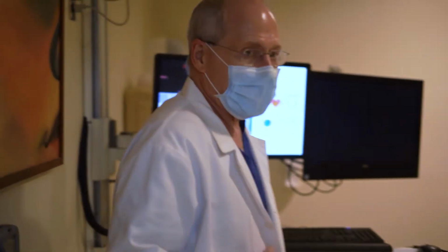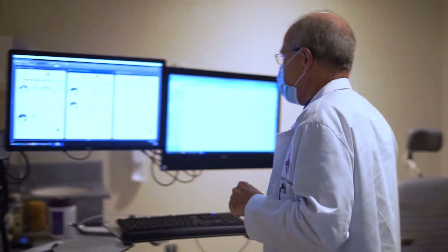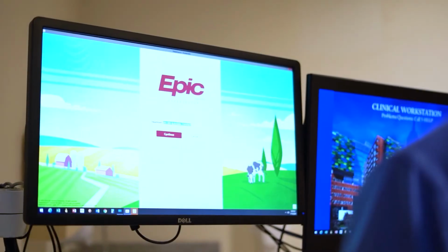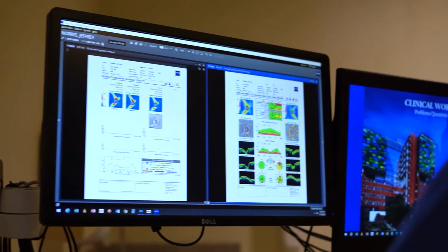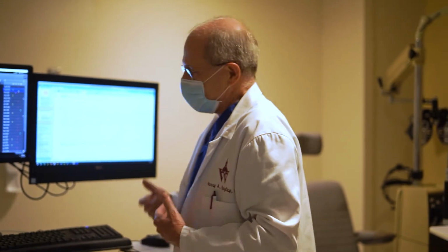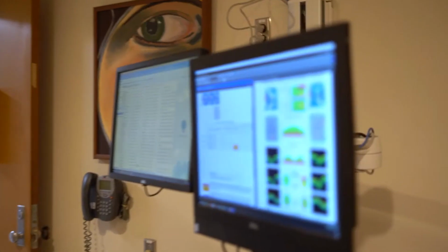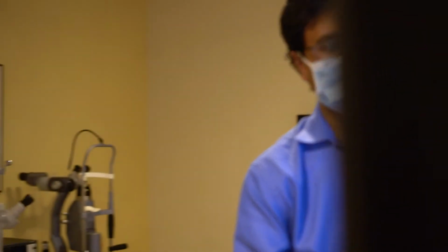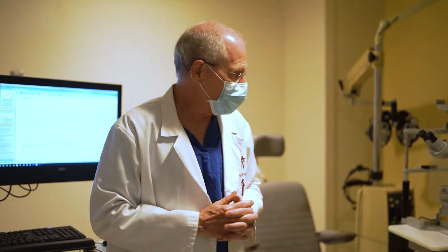And the second main setup room is my favorite room. In this room, the doctor is standing for much of the day, which is good for your circulation, great for your exercise. We have two screens, each one of which shows aspects of the patient's care. Here's a patient's record in Epic, and over here is Forum, where we can see the patient's imaging and fields simultaneously with it. We can go back in time. For many of my patients, that's going back 18, 20 years in the same software, and bringing up their testing so that while we're looking at the patient, we can be looking at their imaging. And very often that's the most important aspect of putting together the entire thought process about each patient.